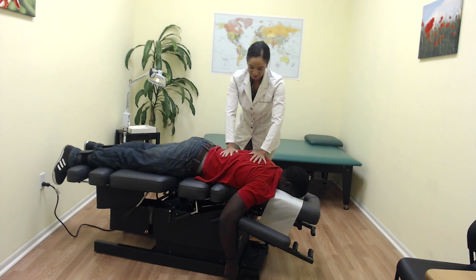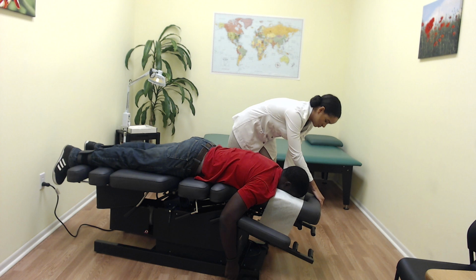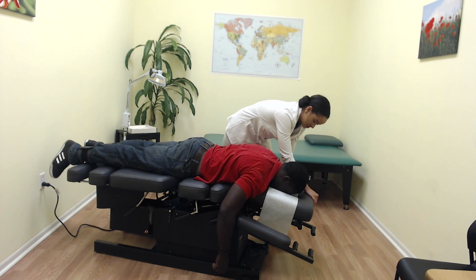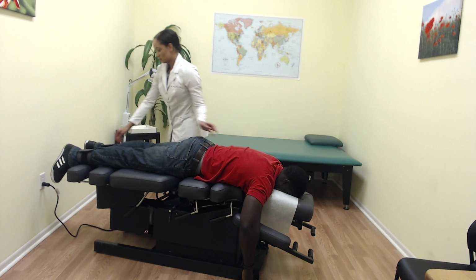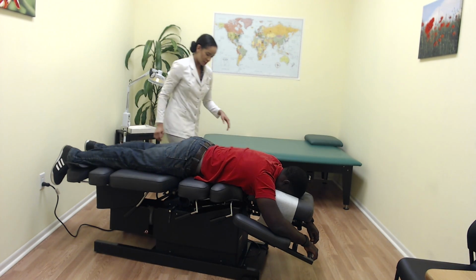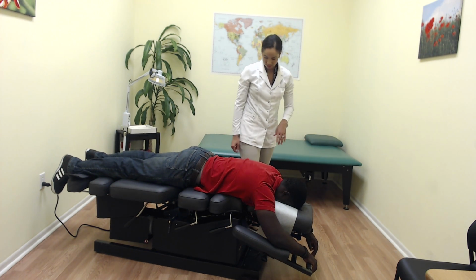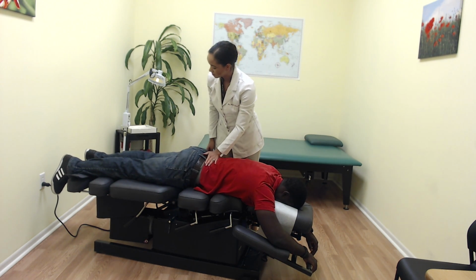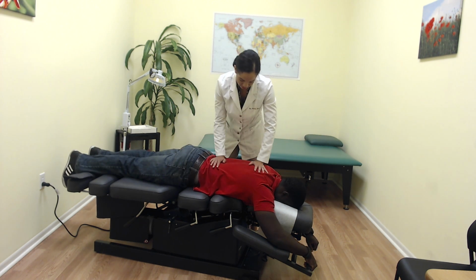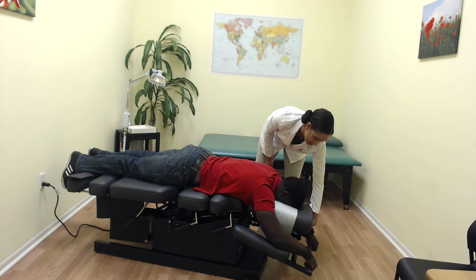Perfect timing on that. So, couple steps we have to go through. We're going to lock the table back into place. There we go. And then we're going to unstrap him and go ahead and lower him down. All right, you can go ahead and lay on your side facing me.